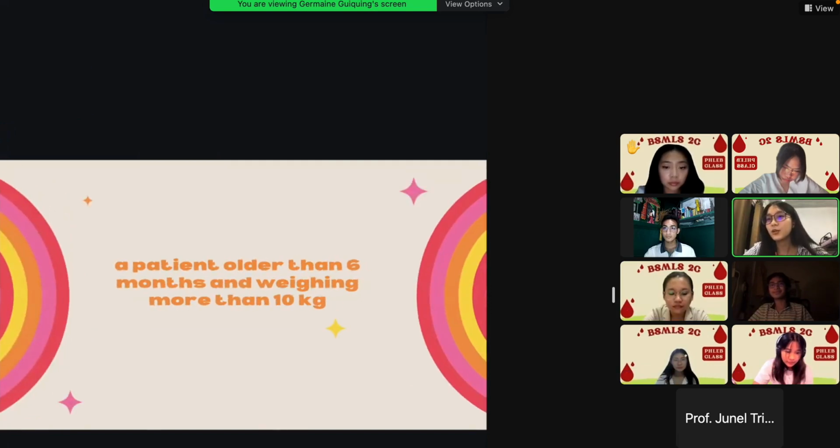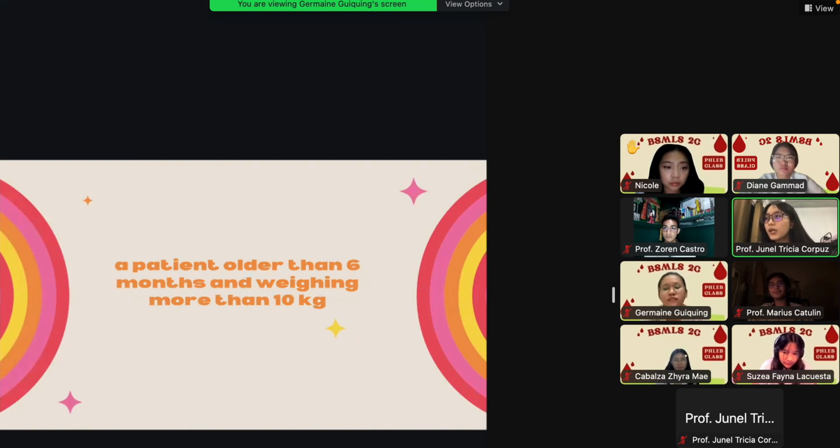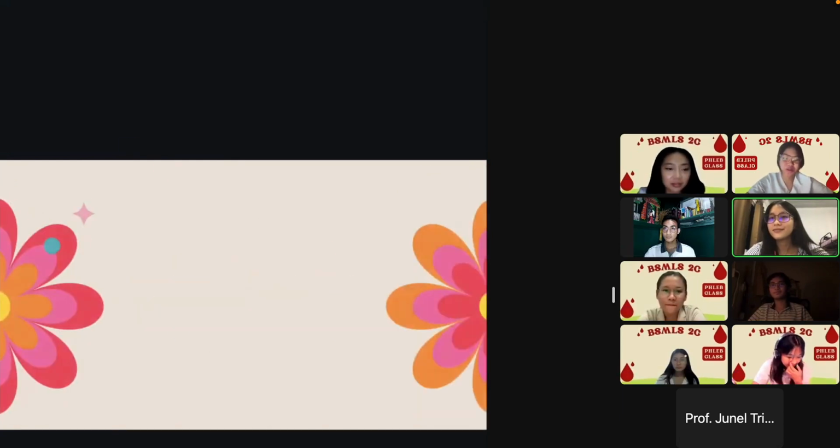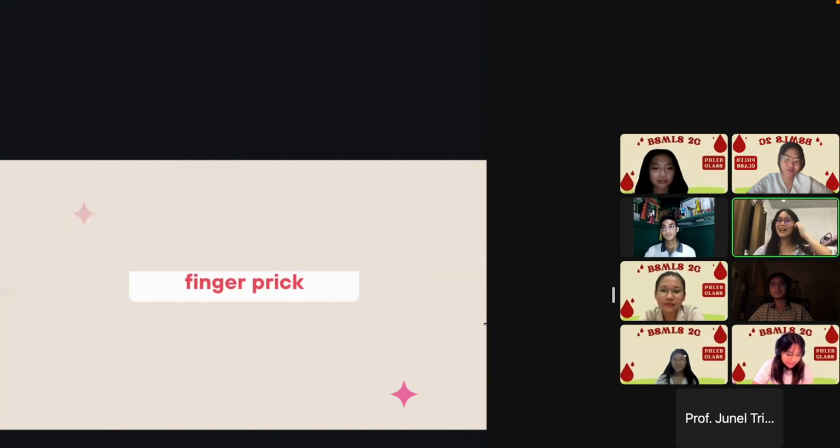Then last, a patient older than 6 months and weighing more than 10 kilograms. So where to prick? Okay, Miss Nicole? Ma'am, finger prick po, ma'am. Let's see. Very good. Wow, it's obvious that everyone listened.